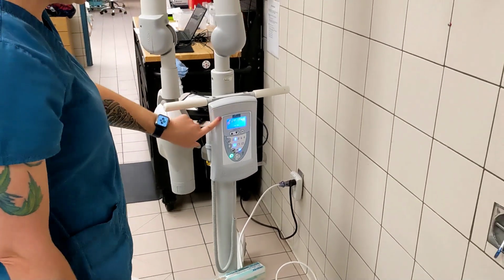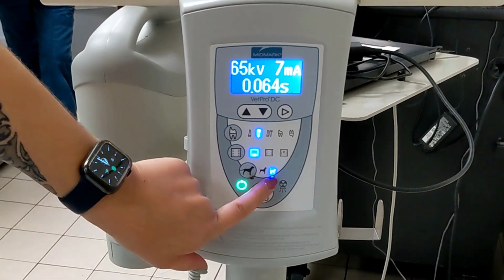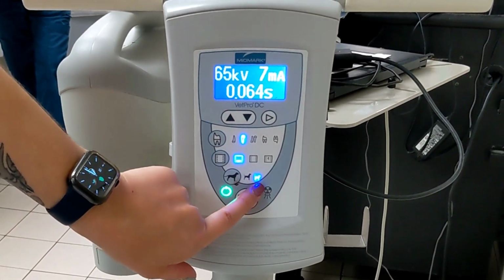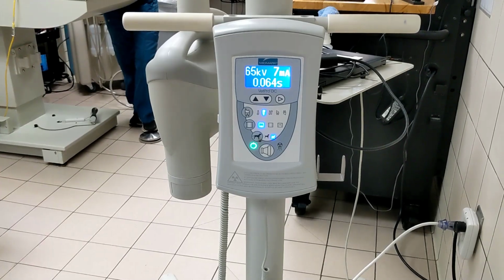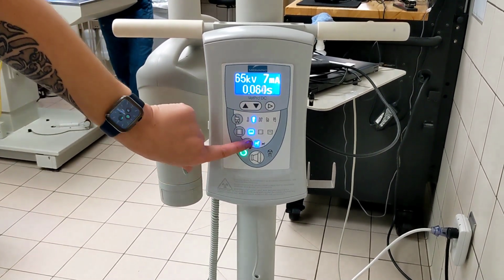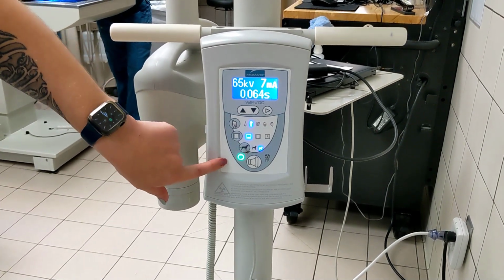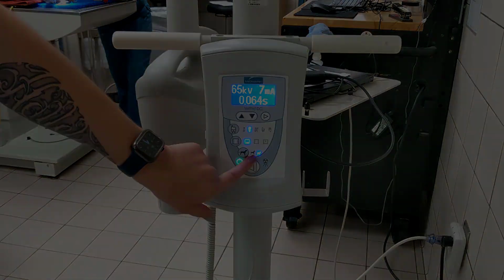The only setting you need to select on the machine panel is the size of animal, large dog or small dog/cat. Push the button to change between settings, and you will notice that the exposure time will change between 0.064 and 0.080. The other settings should not need to be changed from 65 kV and 7 mA.